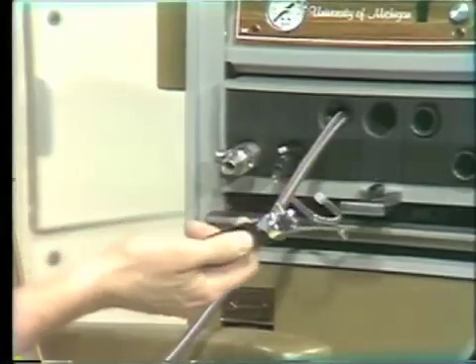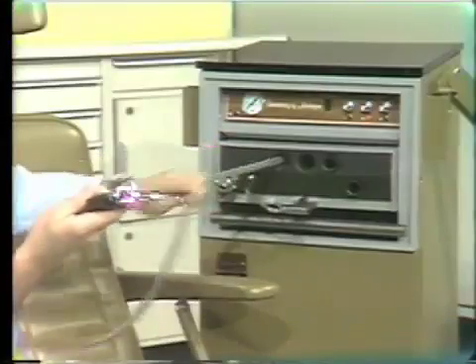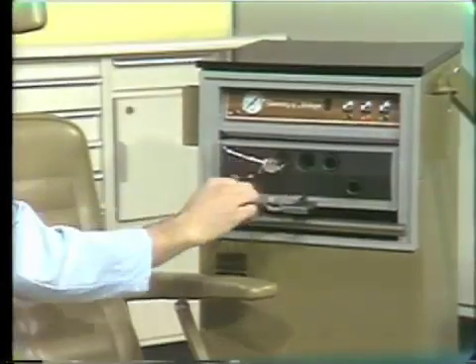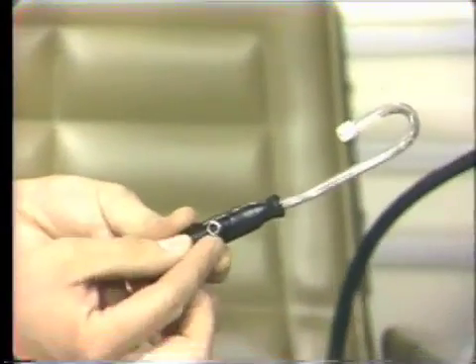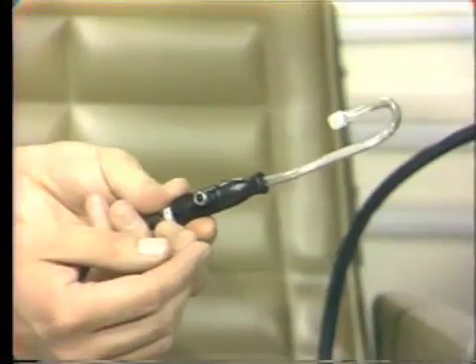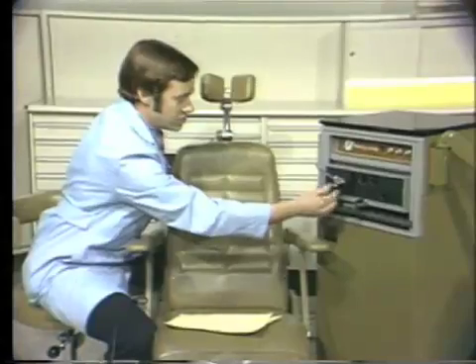The air is on the top portion of the syringe and the water is on the bottom portion of the syringe. The only additional piece of equipment that we'll be using will be the saliva ejector. The saliva ejector is pulled out and is turned on like so. The other portions of the unit will not be used for the procedure today.